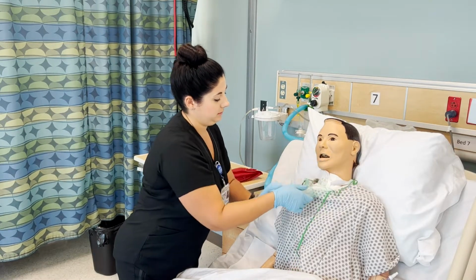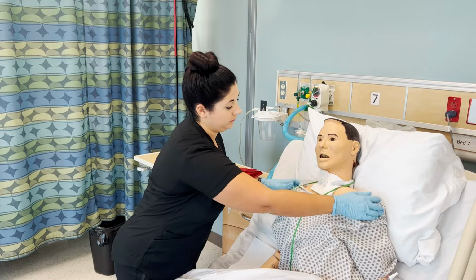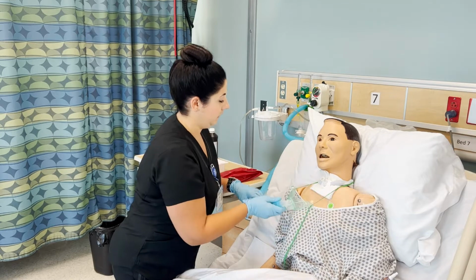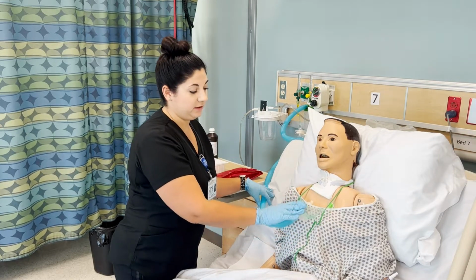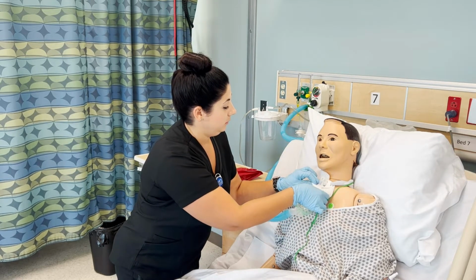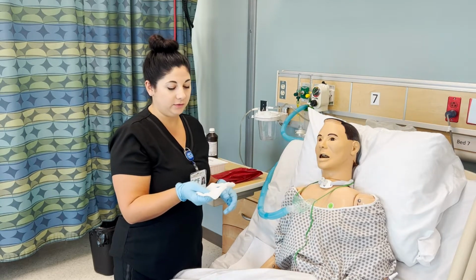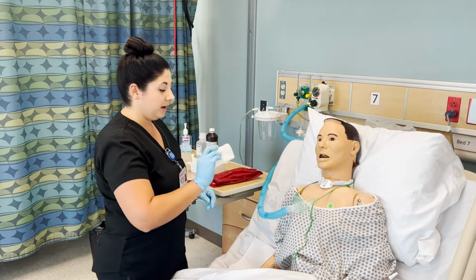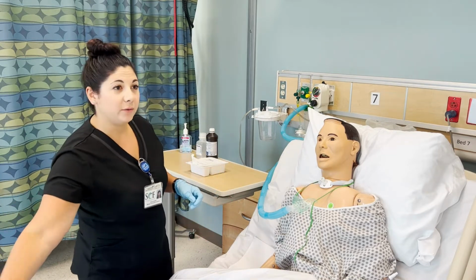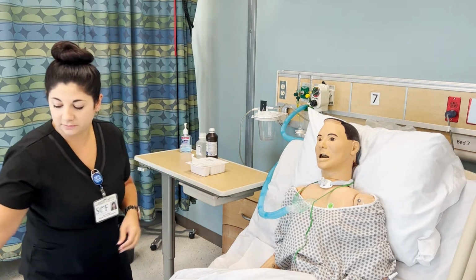We'll loosen his oxygen device and pull down on his gown a little bit so that it's not in the way. You can leave the oxygen mask here. It creates a little bit of blow-by oxygen while you're cleaning. And then we will remove the old dressing. We're going to look at it for color and consistency of the drainage so that we can document that after. If it is soiled with any blood, make sure it goes in a biohazard bag. And we'll get rid of that. And we can remove our clean gloves.